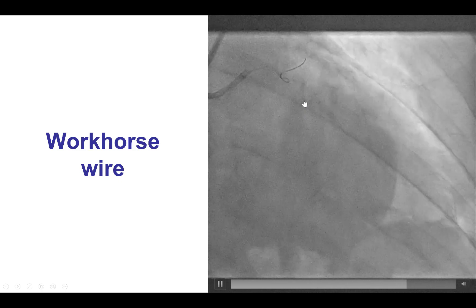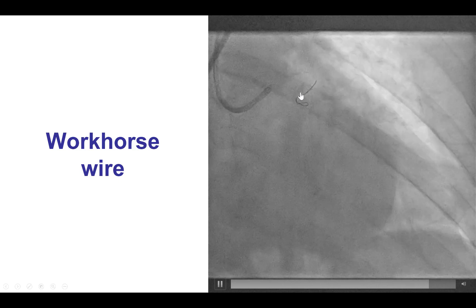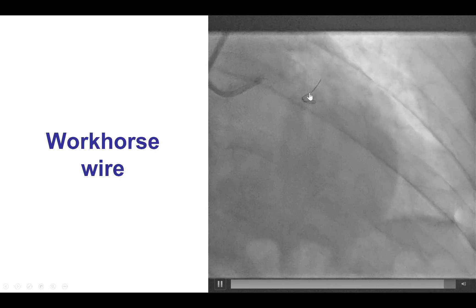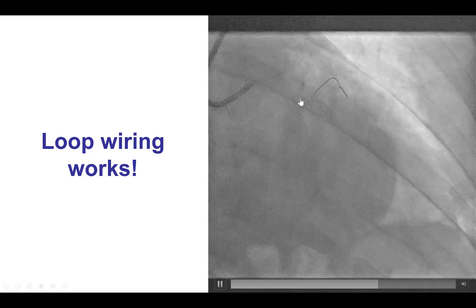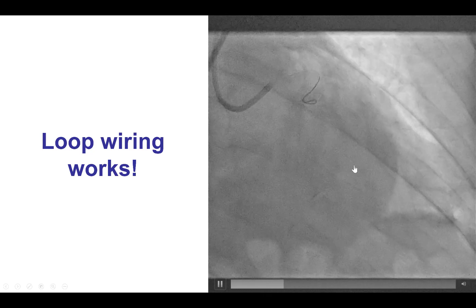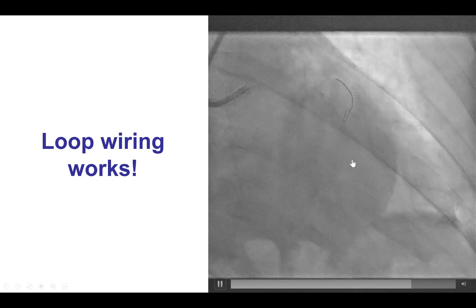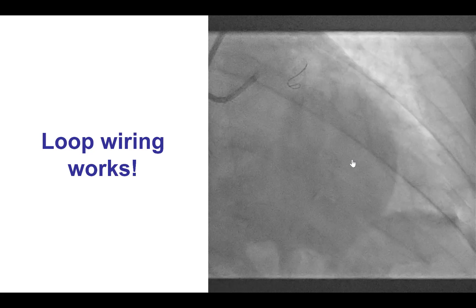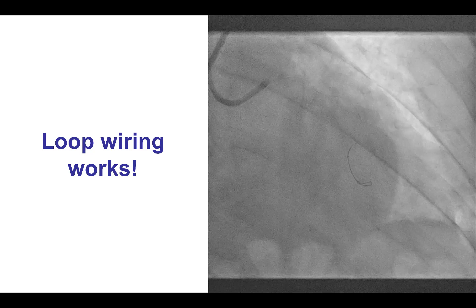Sometimes the prolapsed tip actually can be a good thing, because it prevents the guide wire from going into side branches. And sure enough, we were subsequently able to advance the loop and get it distally into the vessel. So sometimes being patient and just using a Workhorse guide wire may be successful, even in cases of significant tortuosity.